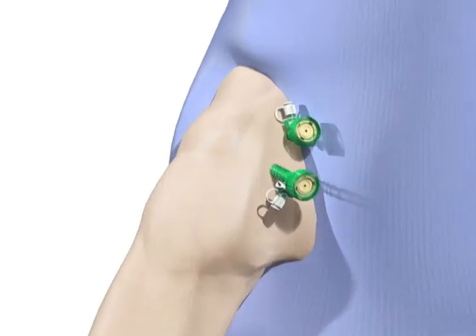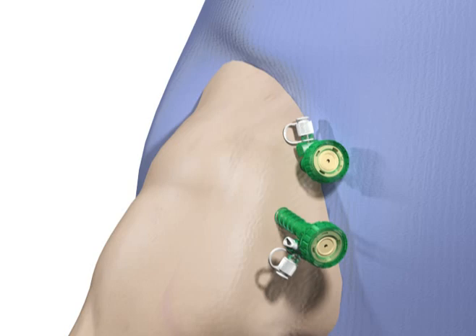Create standard arthroscopic portals in which a diagnostic arthroscopy is performed. This includes a posterior soft-spot portal and lateral portal. Shown here are a rotator interval anterior portal and a second working portal positioned approximately 3 to 4 centimeters inferior lateral to the rotator interval portal.